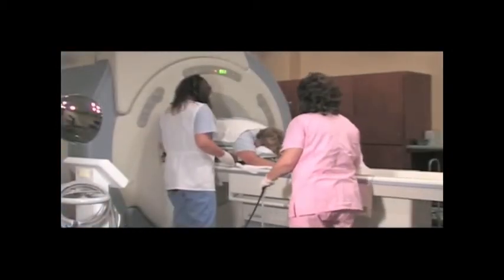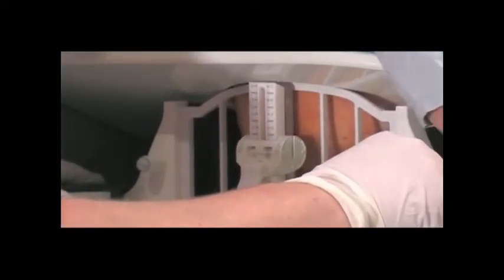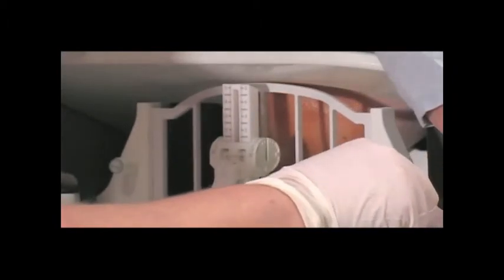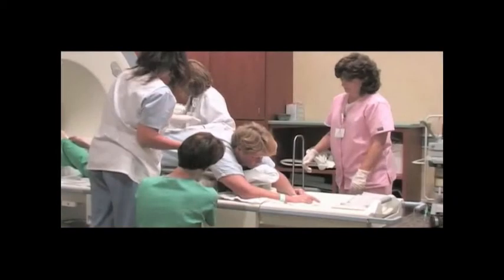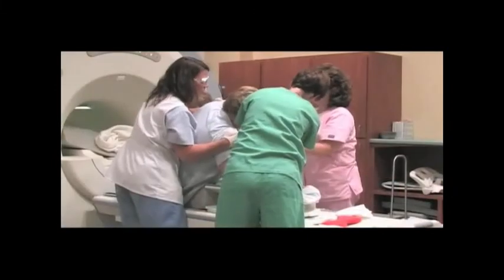Shuttle the patient into the magnet bore for verification of marker placement. Once marker placement is verified, shuttle the patient back out of the magnet bore. Gently remove the introducer sheath from the breast. Slowly decompress and remove the immobilization plate. Immediately apply pressure to the biopsy site and when ready assist the patient out of the coil.